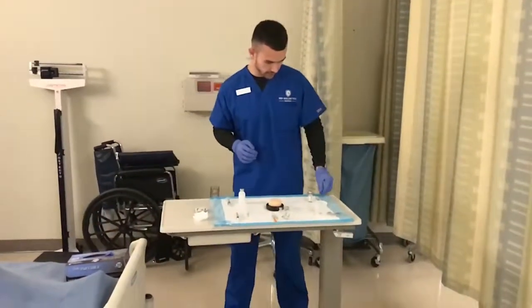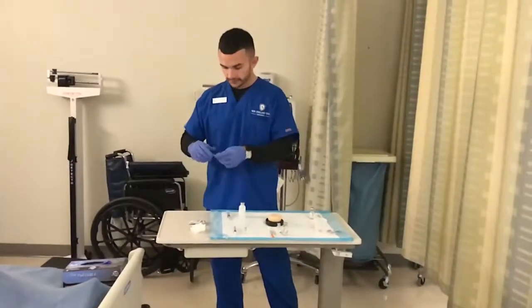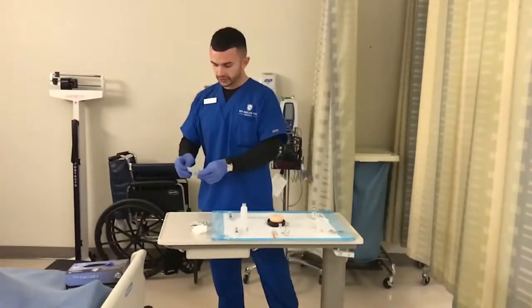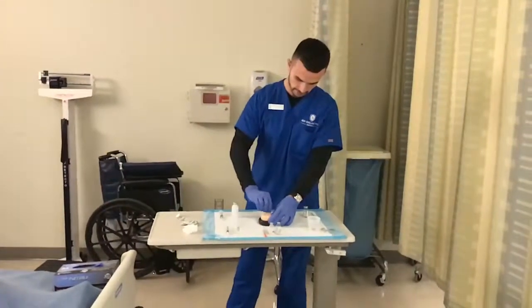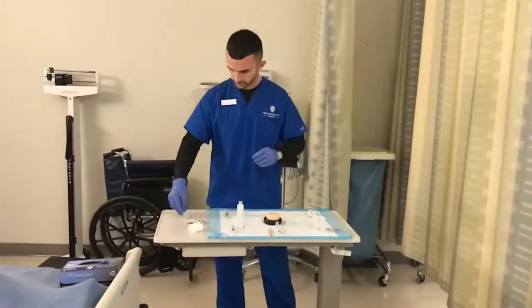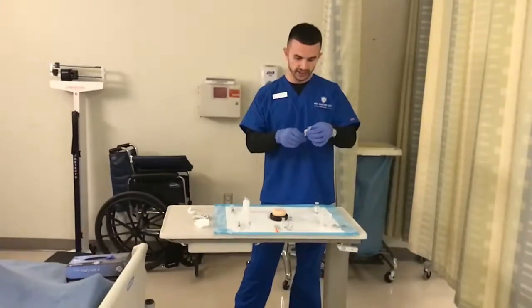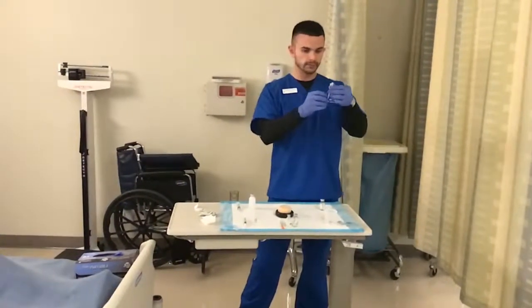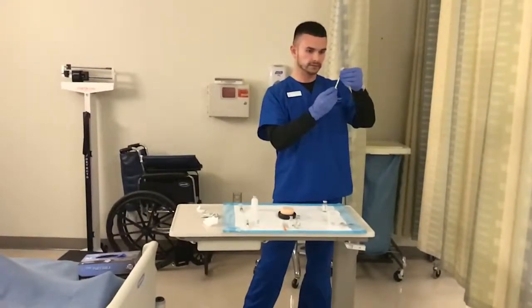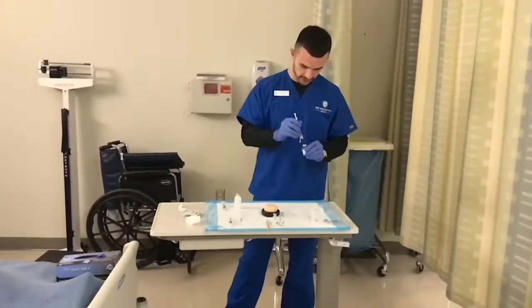So next, moving on, I'm going to do my intradermal injections. So to start, I would take an alcohol pad for any injection, and I would clean the site of the injection from the inner out. So with the intradermal, for this video, we'll say we are going to be giving 0.2 milliliters of injection. So I would draw up 0.2 milliliters of air into the syringe, and I would insert that into my medication vial.